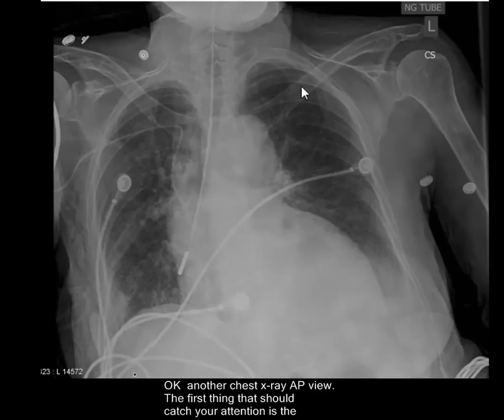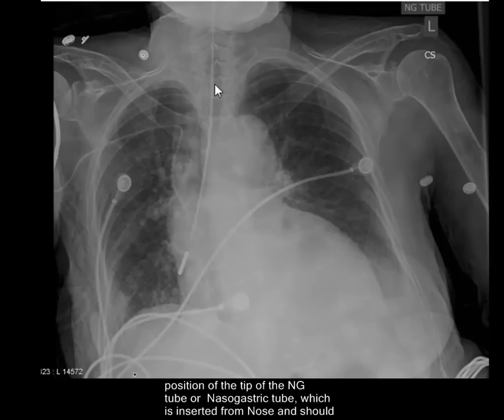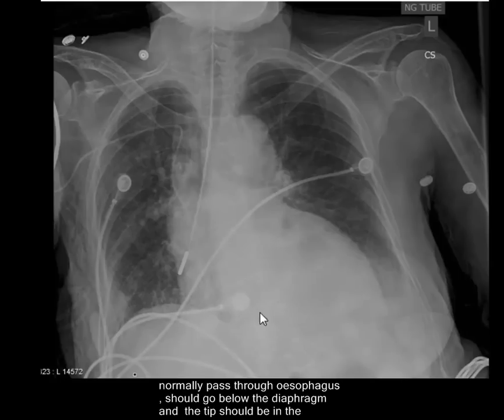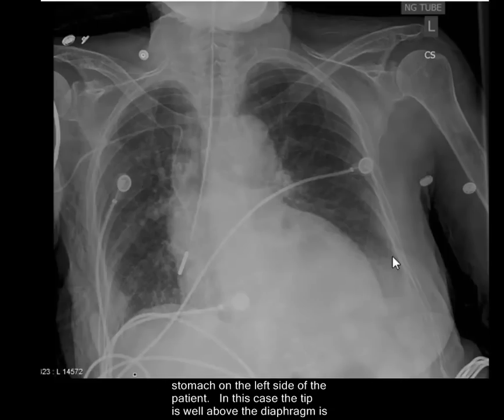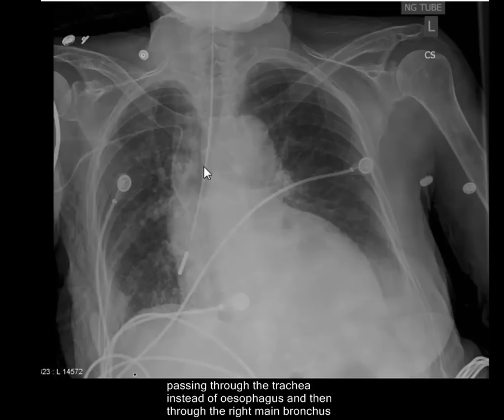Another chest X-ray AP view. The first thing that should catch your attention is the position of the tip of the NG tube, or nasogastric tube. It is inserted from the nose, should pass through the esophagus, should go below the diaphragm, and should be visible in the stomach on the left hand side of the patient. In this case, the tip is above the diaphragm, passing through the trachea — this black column is the trachea.